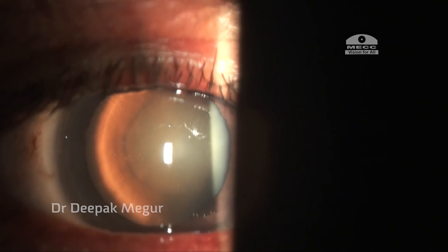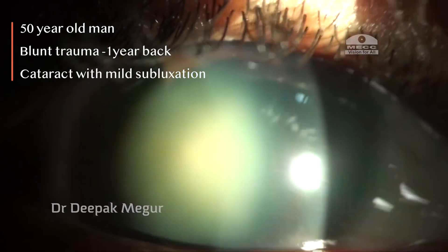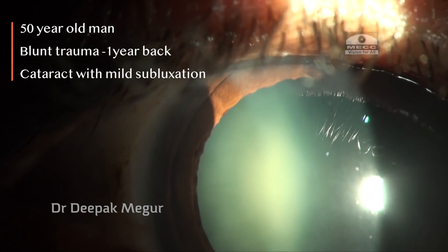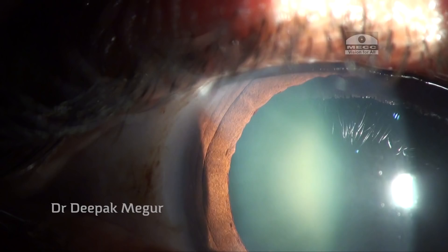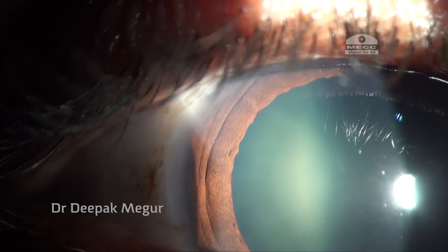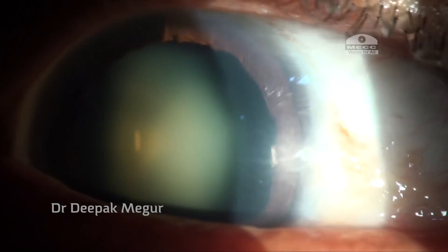Today I'll be sharing a case about a 50-year-old man who has sustained blunt trauma to the eye. Slit lamp examination reveals mild phacodonesis, areas of sphincter tear, and a nuclear cataract with about grade 3 sclerosis. Angle evaluation did not reveal any angle recession.